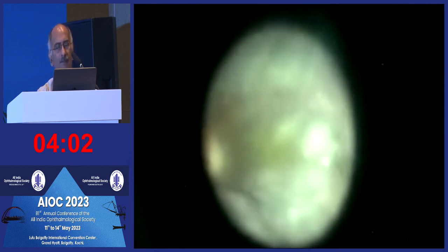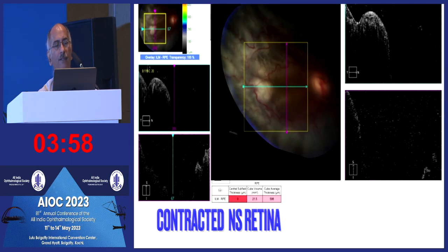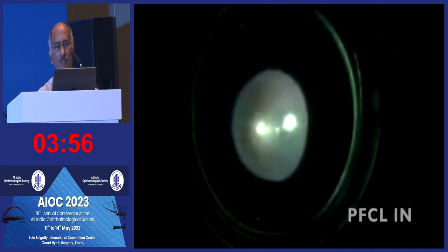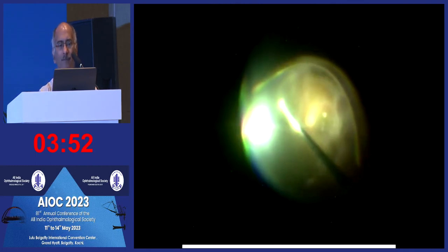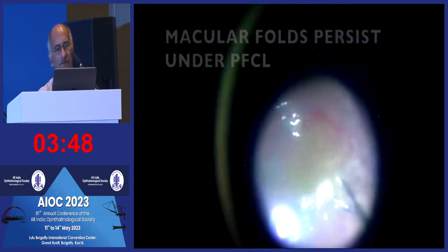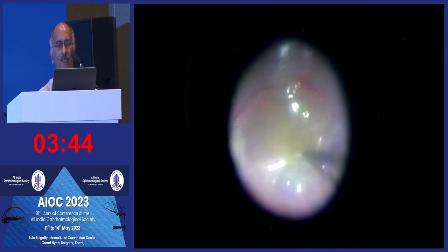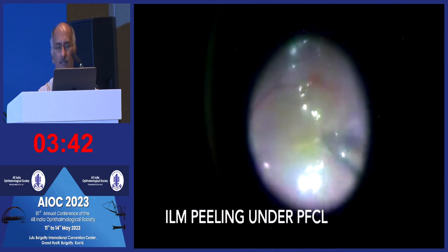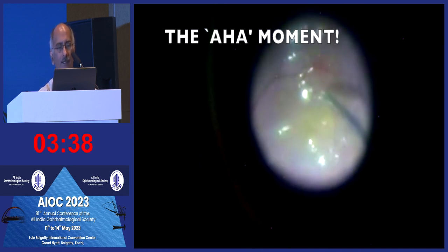The macular tissue was contracted. I tried ILM peeling. Here you can see in the OCT sections. So I put in PFCL finally. A base excision was done. And there were folds persistent at the macula under the PFCL. So I did an ILM peeling under the PFCL.